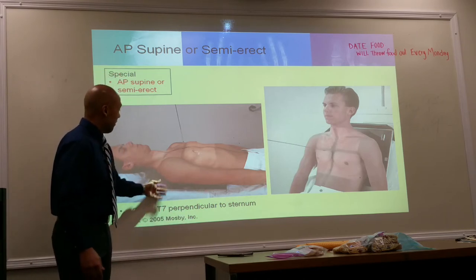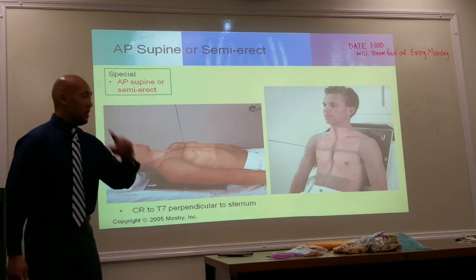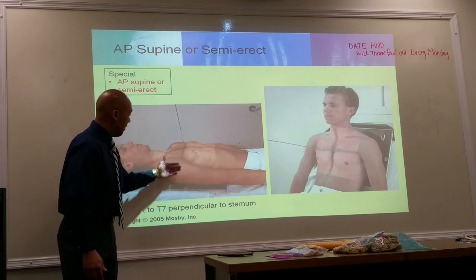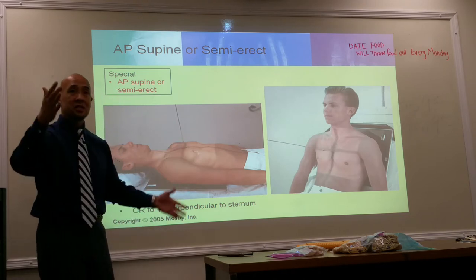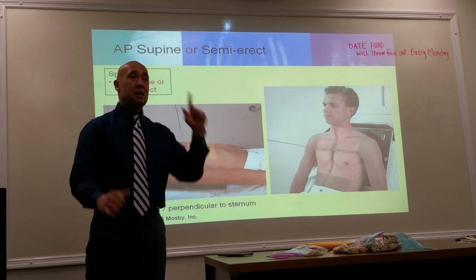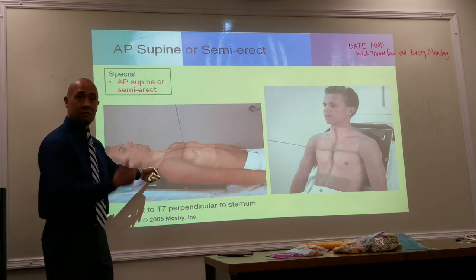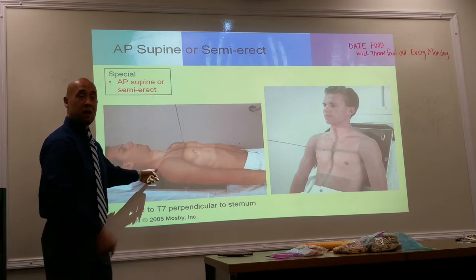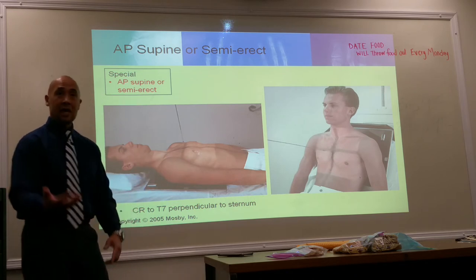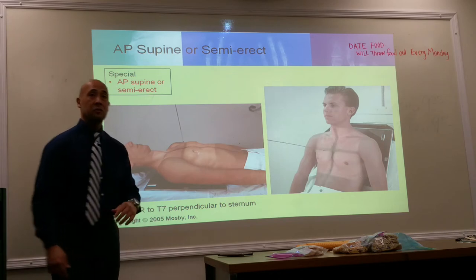Okay? So if I place my image receptor behind the patient, who's like this, I want to make sure that the edge of my image receptor is equidistant on both sides of the patient. Okay? Top border. I'm going to place the top border at the level of the vertebral prominence. Vertebral prominence of C7. Okay? And then I will line up my X-ray tube accordingly to my image receptor.